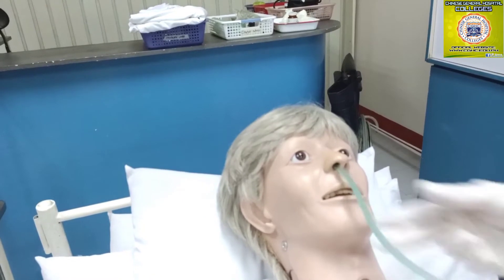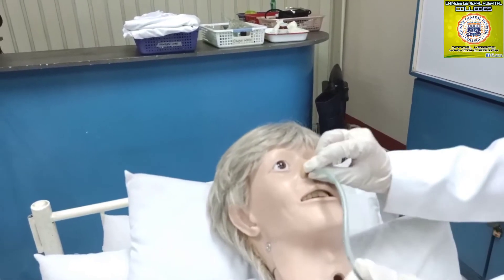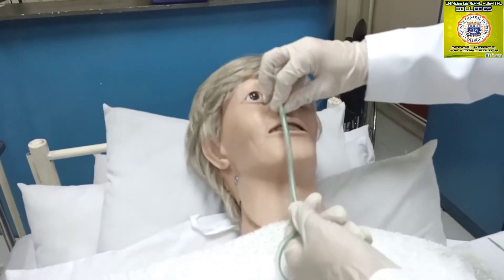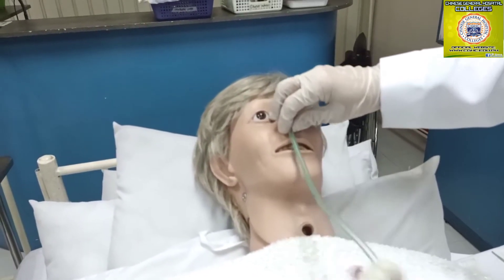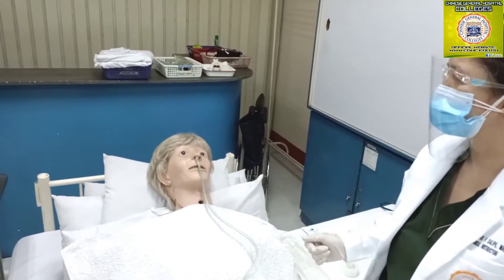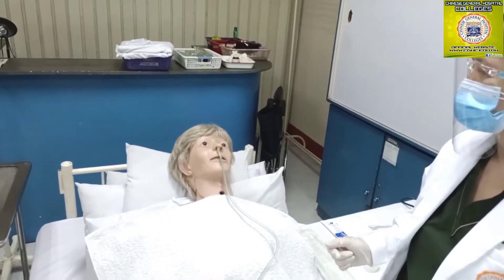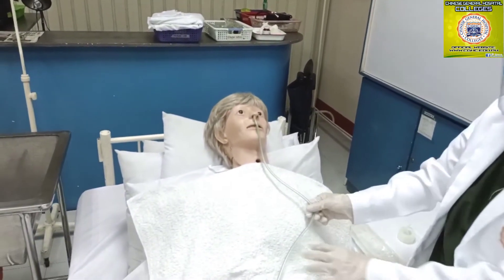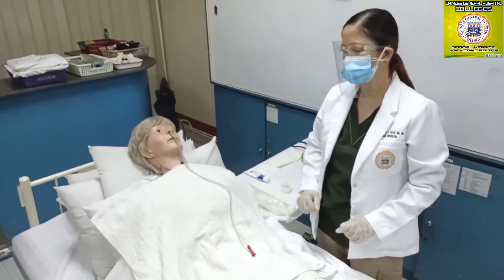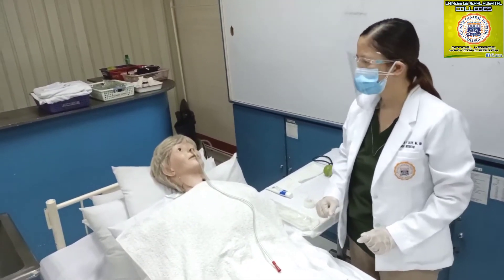Since you have no actual patient, continue advancement. Once the tip of the pharynx is reached, instruct the client to swallow while the tube is being advanced. Discontinue the procedure and remove the tube if gagging or coughing occurs, or if signs of distress such as cyanosis and inability to speak are observed.